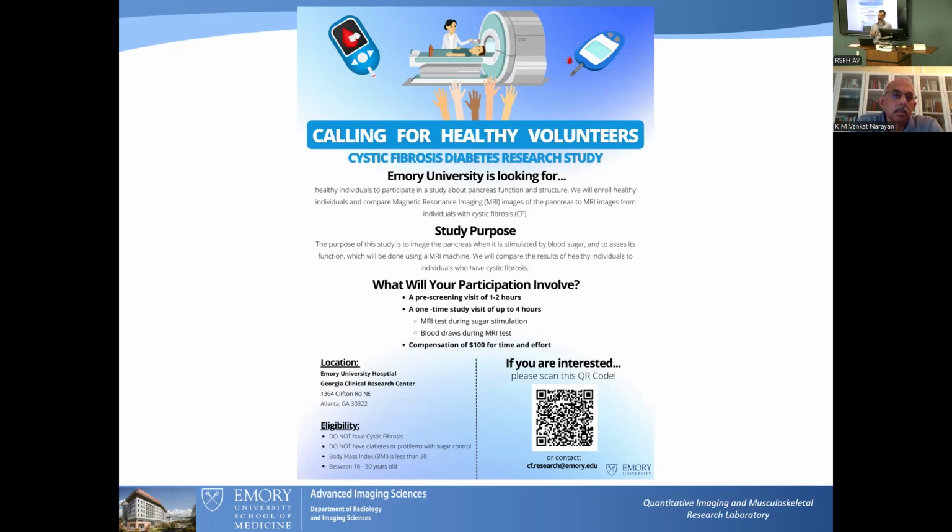Okay. So unfortunately, it's not ever going to be that high resolution, but I do think that it still allows us. I mean, that still hasn't impaired a lot of uses of fMRI in the brain, for instance, where it still has the same spatial limitation, but you're still able to get a lot of specificity with that time-space kind of analysis.